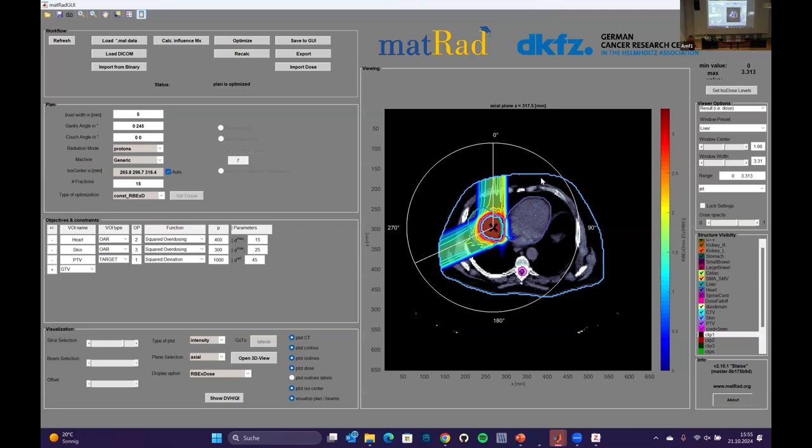There's a problem, right? When you have a dose that is super localized in depth, I create a proton beam and it goes into my patient and it stops at 10 centimeters of water equivalent thickness. Then you count on that when you irradiate the patient, that there are 10 centimeters of water equivalent thickness. If there is not, because there is suddenly a little bit more air in it, or something that had air in it filled, then the peak of your dose will shift dramatically.